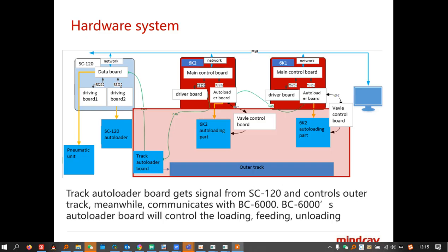And one important piece of information in the installation guide: after you install the machine, you need to install the software, right? The software includes the CMU and the LabXpert. After installing the CMU, you need to go into the auxiliary tool to set the IP address in the same position as the CAL 8000 CMU auxiliary tool.